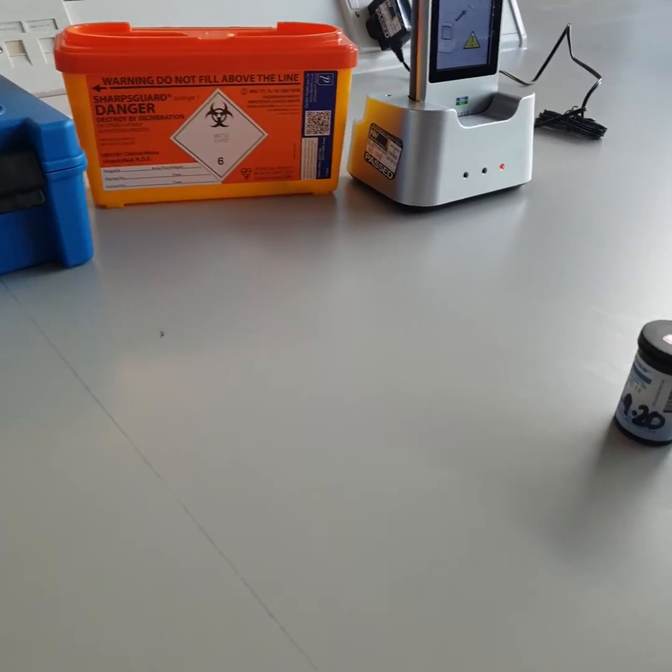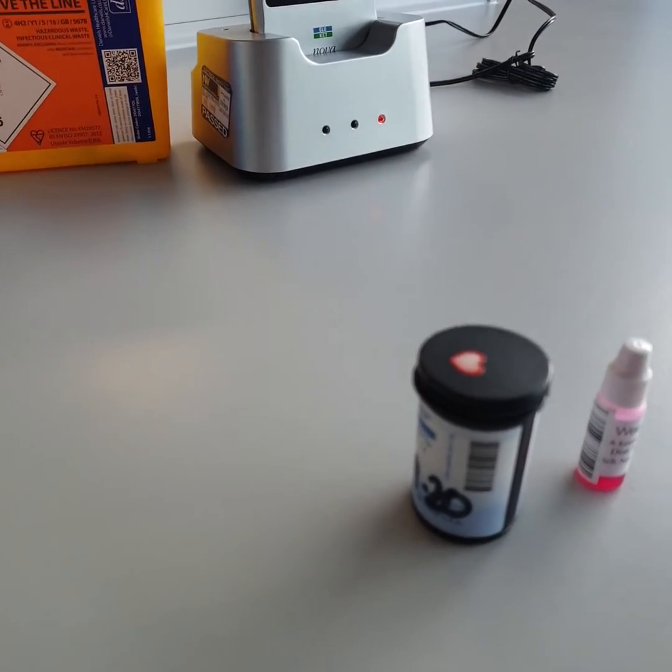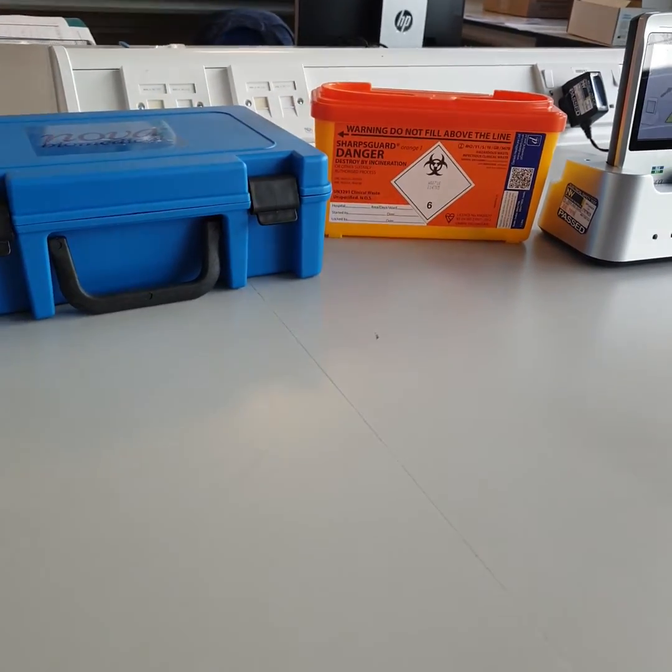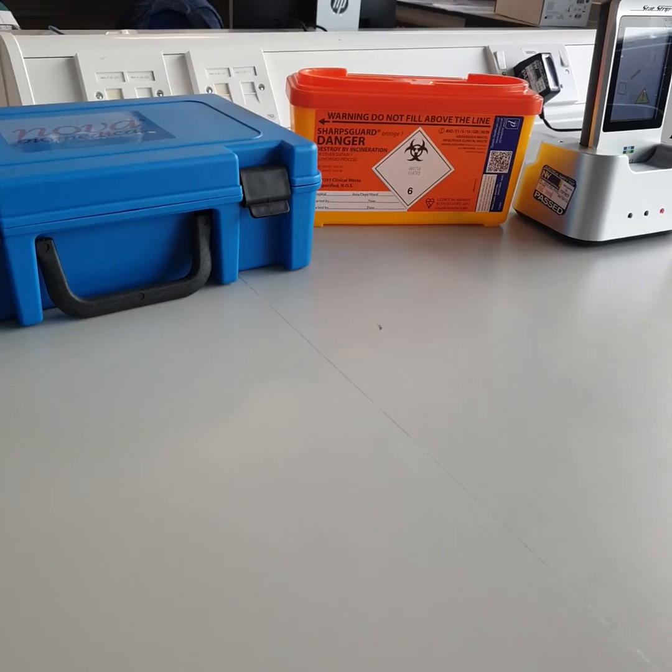These EQA samples are distributed every three months. The testing window is two weeks from date of distribution. Any tests performed after the testing window will be invalid.